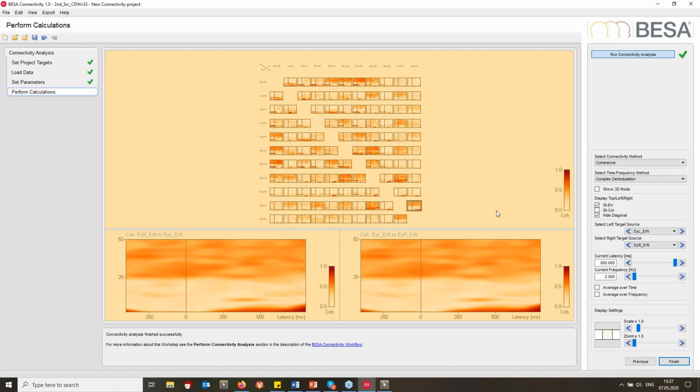Even though I've now moved from the sensor into source space, some noise will be enhanced in the same way. Noise that could not be modeled by the sources will be modeled in the same way by different sources. So that'll create some artificial coherence in the high frequencies that is probably not a real effect.